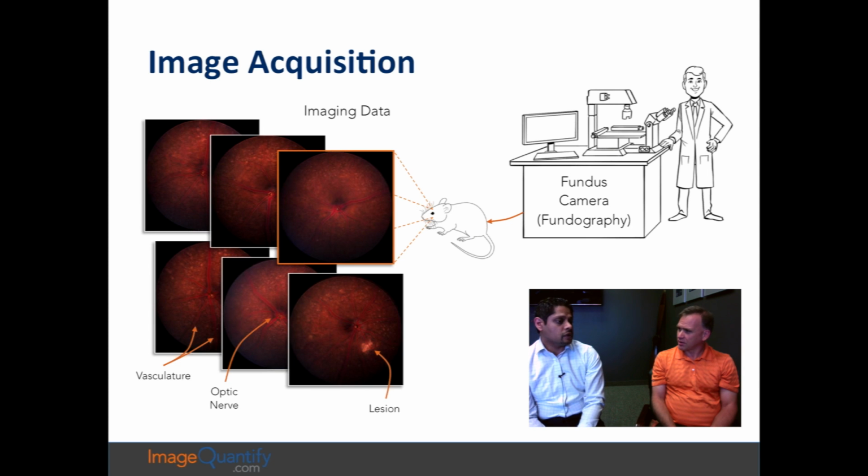I think there are some scopes that actually do a video, and then they're using the frames to do the averaging. For the most part, I think it's acquiring multiple images and then averaging. And you average them later, or usually the scope does it. The scope does it. Yeah. But it takes longer to do the imaging when you do that. Right. And also, if you're doing that, you have to really make sure you're not moving, or otherwise you're going to get a really blurry image. Real blurry. Yeah, that makes sense for sure.